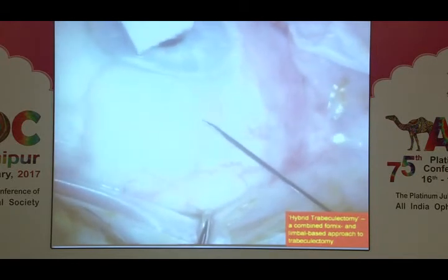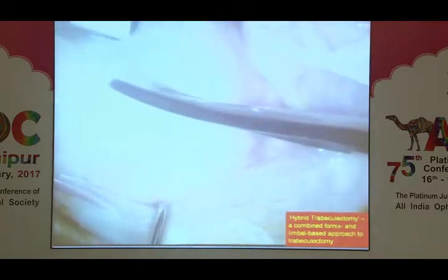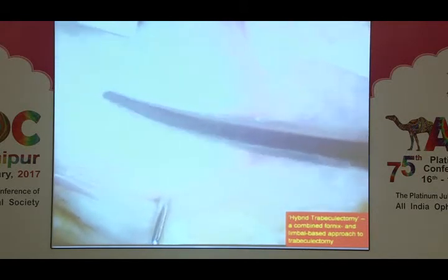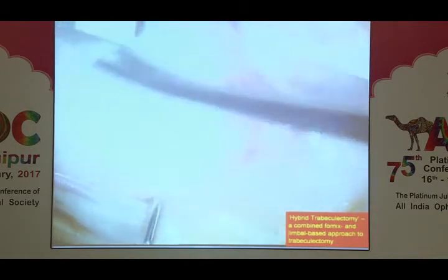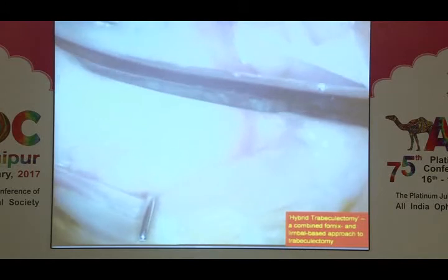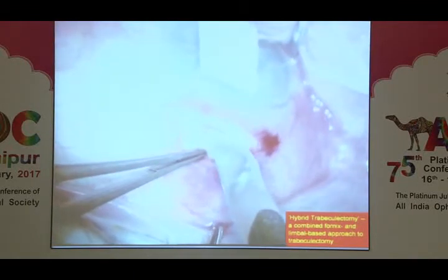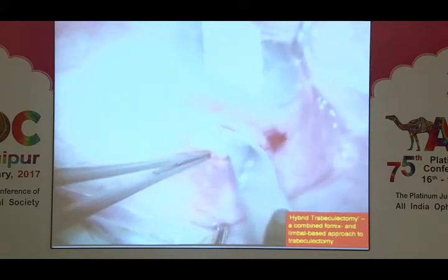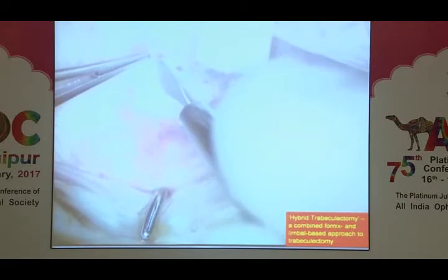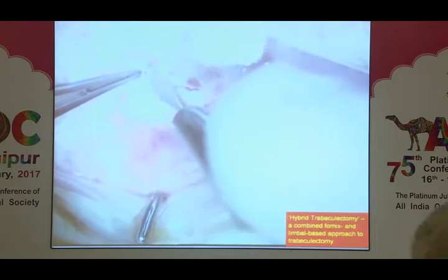What it does is it slightly paralyzes the superior rectus, and paralyzes the top portion of the iris where you're operating. So when you do the iridectomy, the patient doesn't feel any pain whatsoever. Further, because the superior rectus is slightly paralyzed, they just keep looking down. On a rare occasion where the patient has some sort of gaze palsy and you can't make them look down, you may have to put a stitch and pull the cornea down. I don't even put a corneal suture for these patients. Just ask them to keep looking down, and they do perfectly well. The important part here, as you can see, is that I take the scleral flap at least a millimeter above the conjunctival frill.